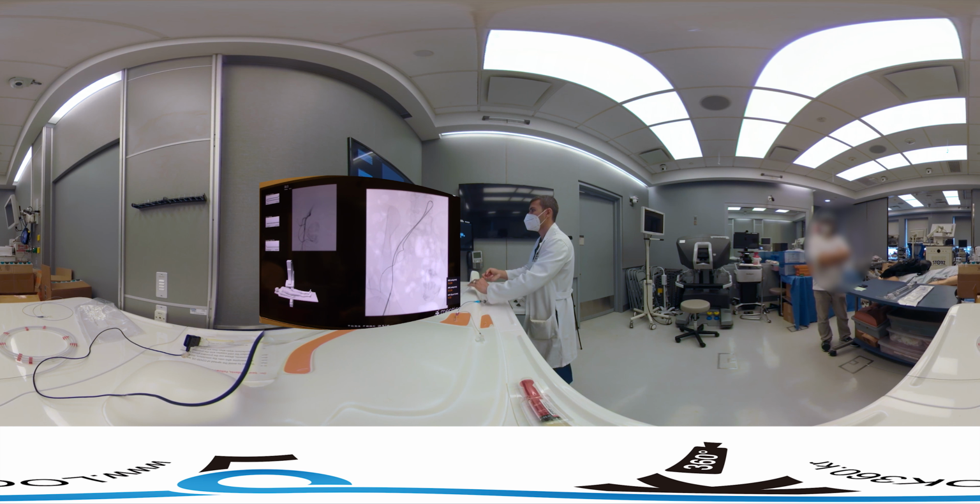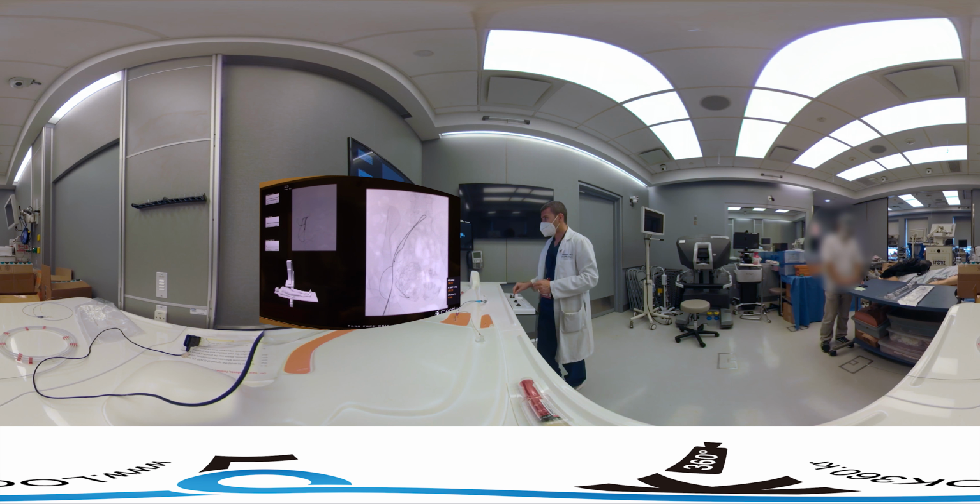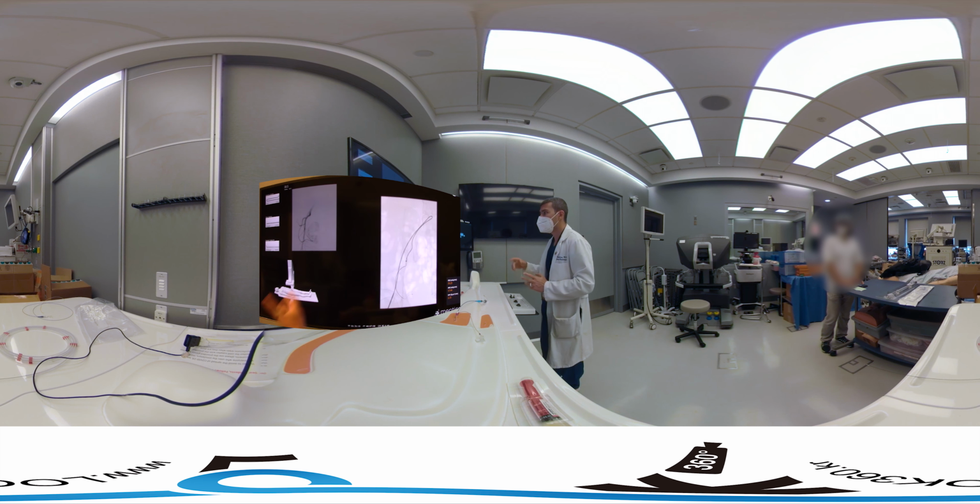What we'll do is get a little bit more micro wire out into the lateral portion, and we'll follow with the microcatheter. And that may be a good spot right there in that lateral aspect of the uterine artery to do our embolization. Let's see. Yep, that looks perfect. So what we're going to do here is collimate. We're going to go back to AP, and we're going to do our injection from here.